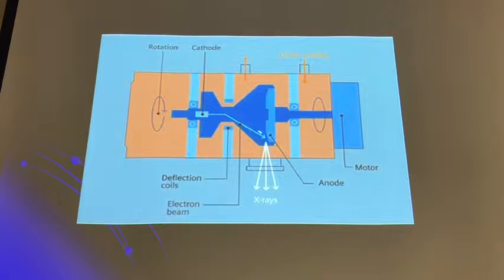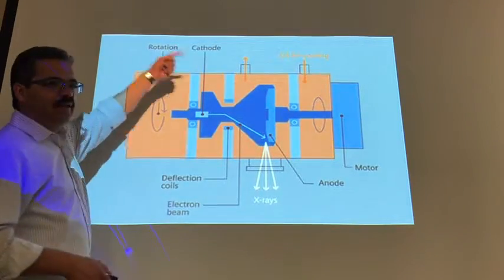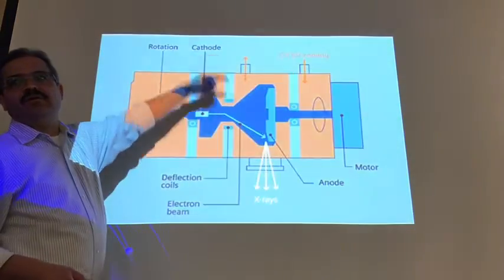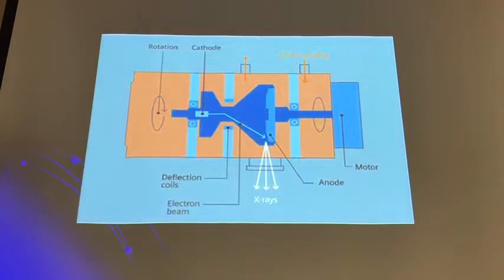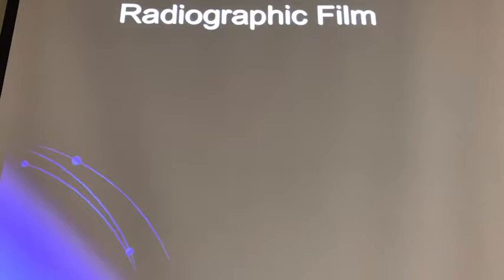The advantage is that you have more electrons hitting the target. That's one of many. And then you see here, all of this is rotating as before. You still have the oil. And outside here is where I said they have the wires that run chilled water throughout. People have tried different ideas.